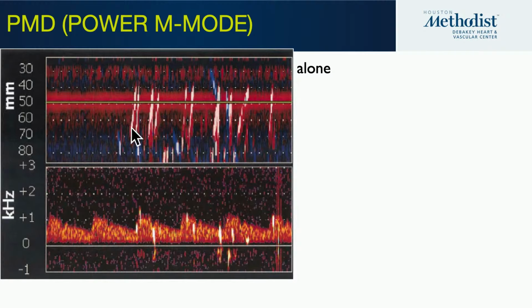You see that the distance from here to here is a little bit bigger, and that distance narrows down when you get to the distal MCA. Why? This one is traveling slower. This one is traveling faster. So this is a sharper upstroke. This is a little bit slower, so that's why it's a shallower upstroke.